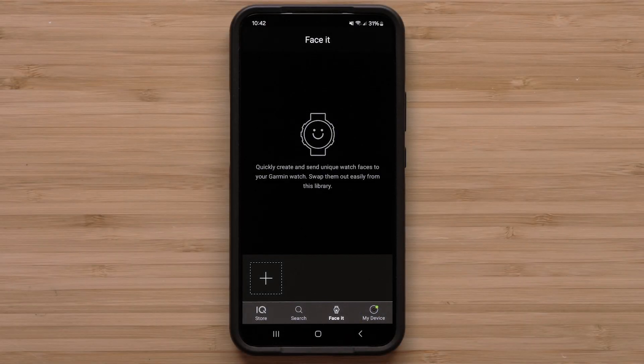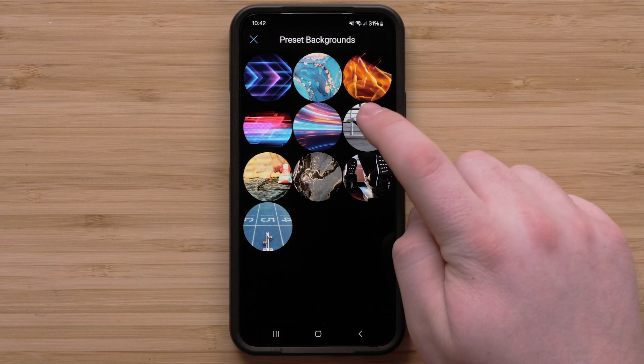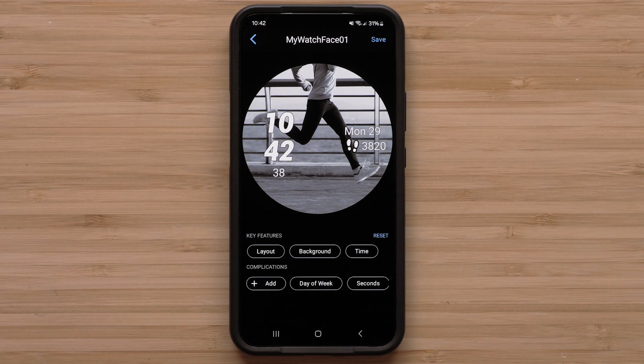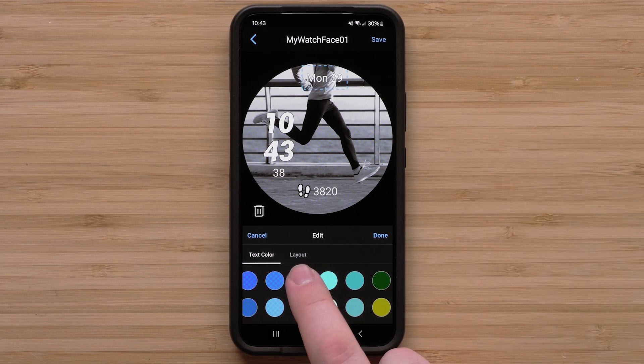Select the plus sign to start creating a new watch face. You can then select to use a photo from your stored photos, take a new picture, or use one of the preset backgrounds. After you have selected a background, you can select a layout from the options displayed. Now you can customize the data displayed by moving, changing colors, or deleting that option from the watch face.